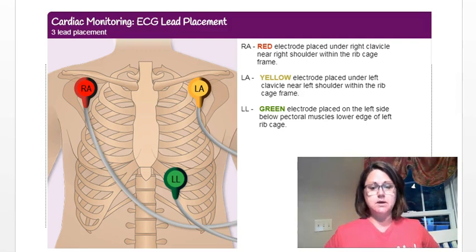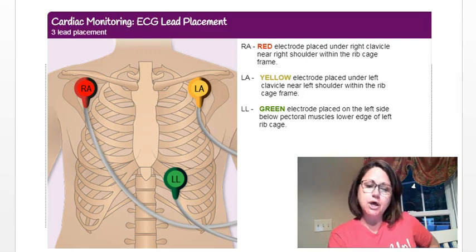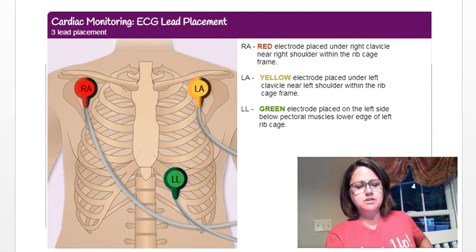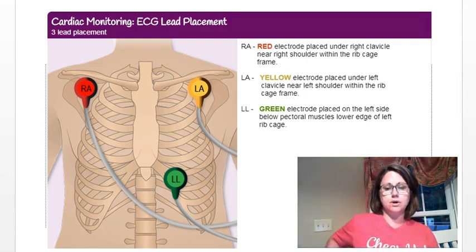For the lower lead, you have a lot of flexibility. If it's labeled LL, place it on the left side somewhere on the lower part of your rib cage — you can go even lower than shown in the picture. If your kit has RL, you'll want to place it further down on the right side of your body.